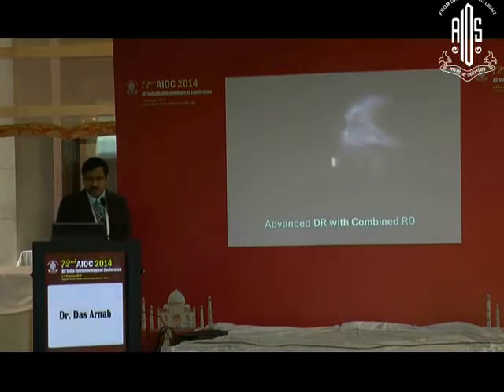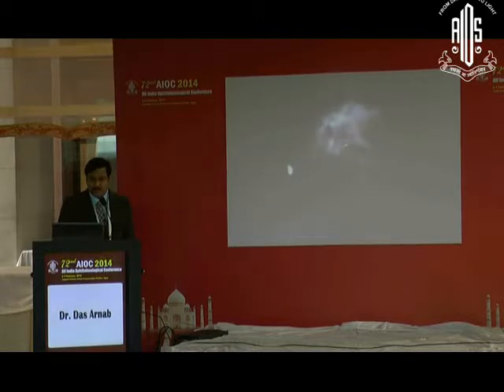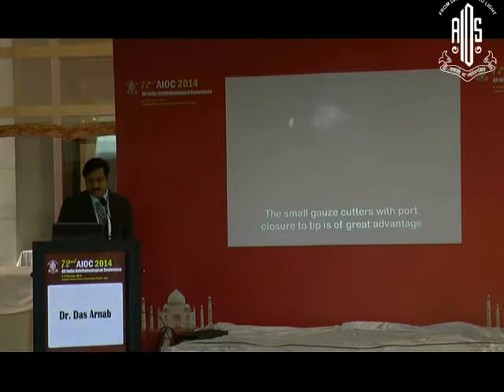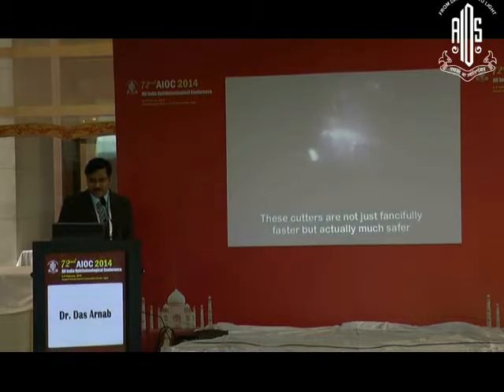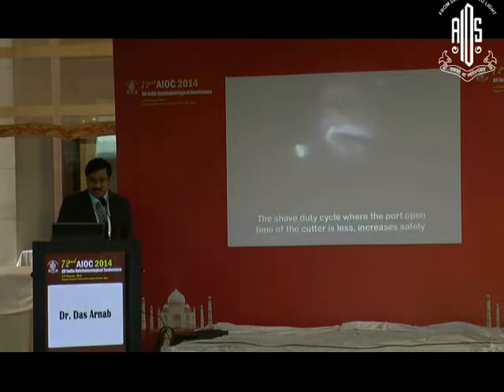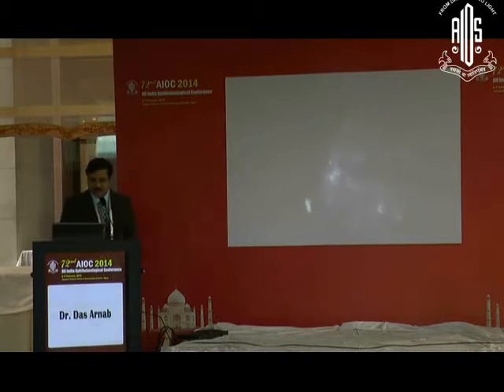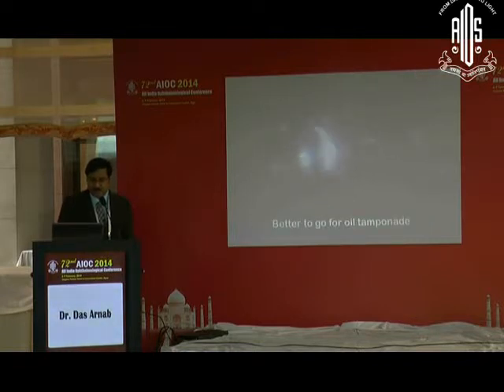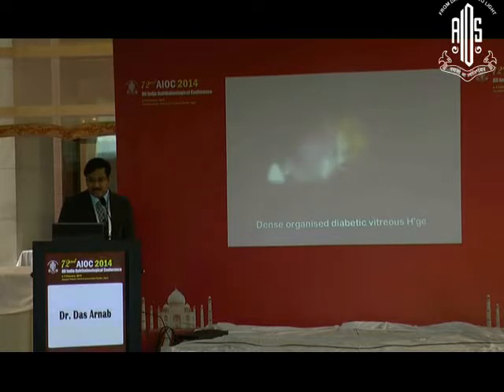This is a case of advanced DR with combined retinal detachment — this is not a walk in the park. The small gauge cutters with port optimization are helping us in a big way. There is an underlying detachment in this case. As Dr. Sina was showing, these high-speed cutters are not just faster but cause much less tissue drag, and with duty cycle variation things have improved. We are doing a vitrectomy followed by endolasers; in this case we did a silicone oil tamponade. This is an organized dense vitreous hemorrhage.